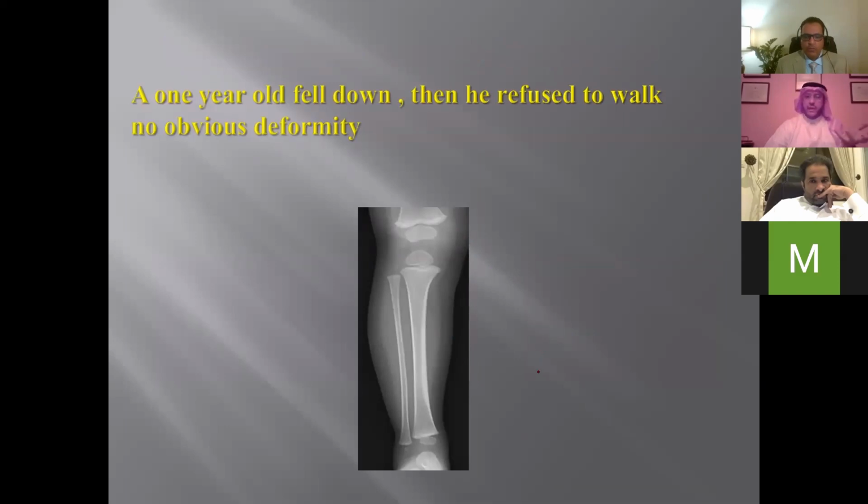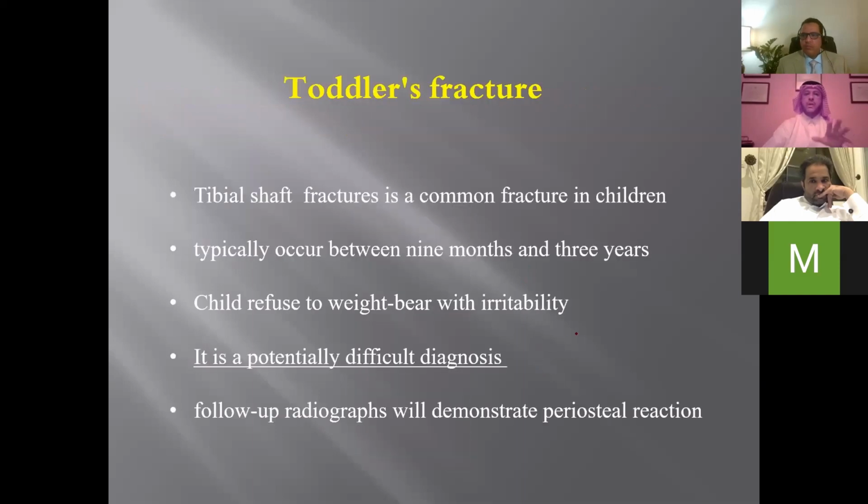When you do X-ray, you don't see anything. But the kid is not able to walk. He's refusing, he's just elevating. When you hold him on his feet, he actually raises the affected one. So think about what we call toddler fracture.